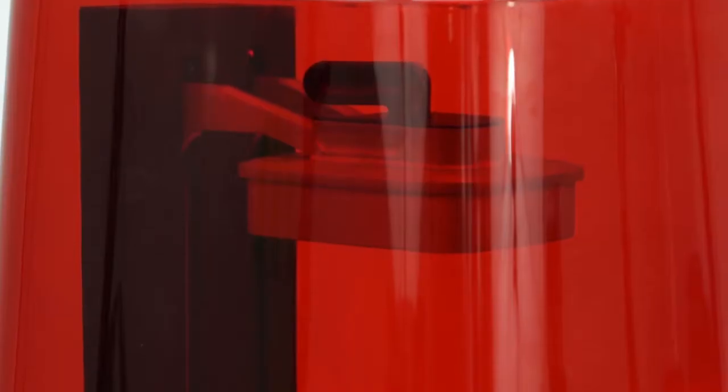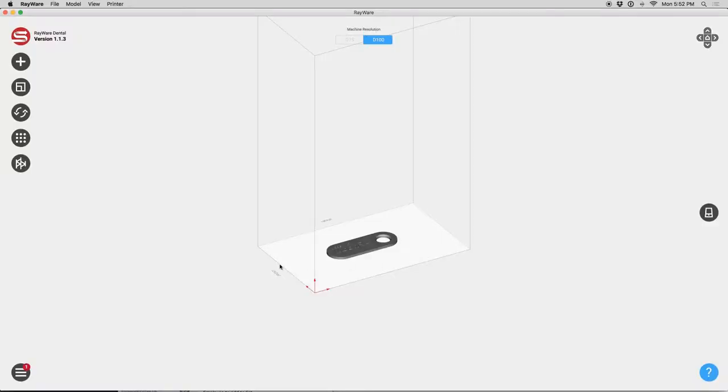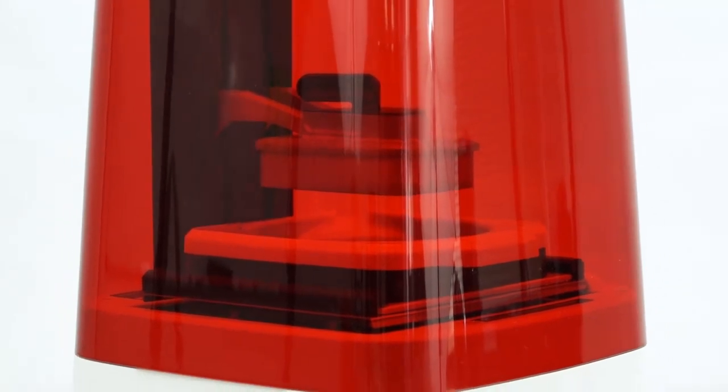The build platform will lower as your print begins. The bottom left button in Rayware opens the Manage Printers window, where you can check the status of your print. You can also pause or cancel a print from this window, as well as adjust connection options for your Moonray.